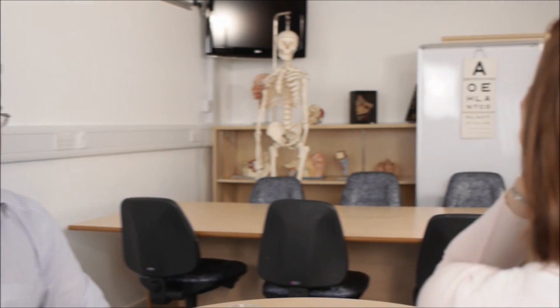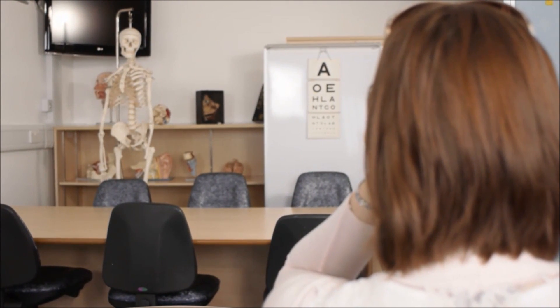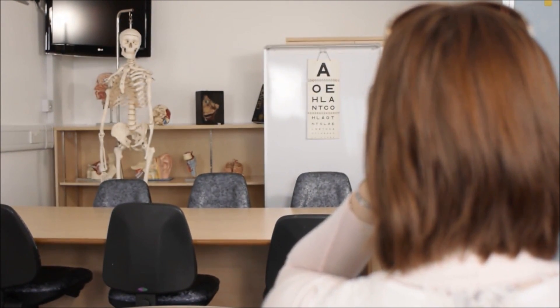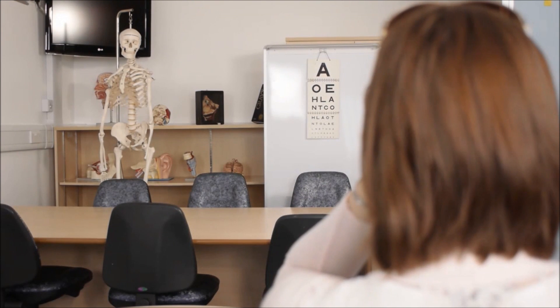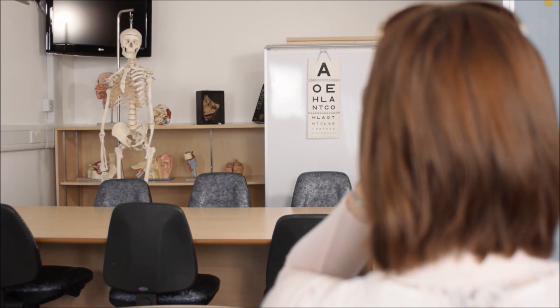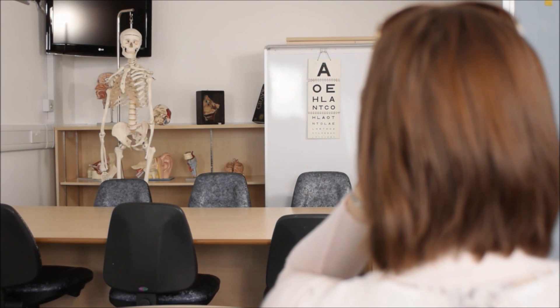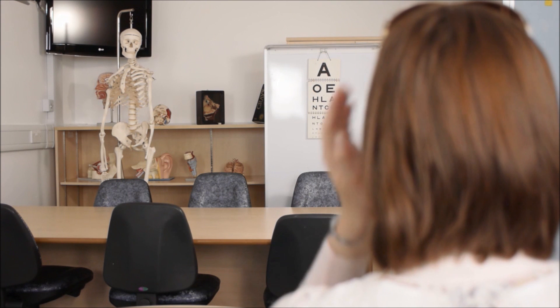Say to the patient: please cover your left eye and read the lowest line that you can clearly see out loud. The patient reads: N, T, O, L, A, E. Thank you.